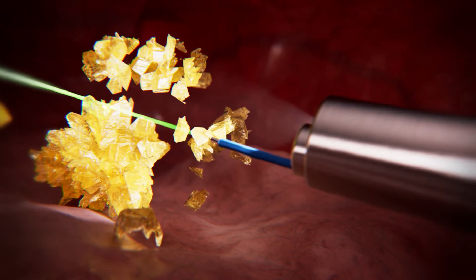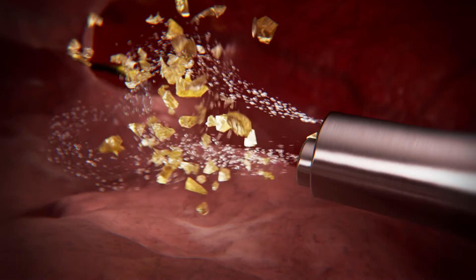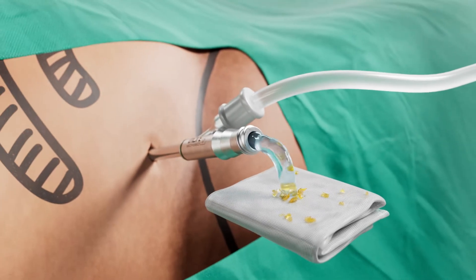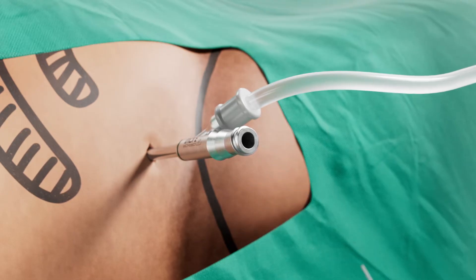Following stone disintegration, the inner sheath and the Ultra Mini nephroscope are removed. With the help of syringes, saline is pushed through the irrigation channel and the ureteral catheter from above and below, causing the stone fragments to expel through the water jet sheath. The process of breaking up stones and flushing them out may have to be repeated a few times until full clearance has been achieved.